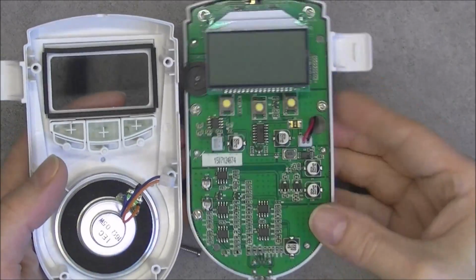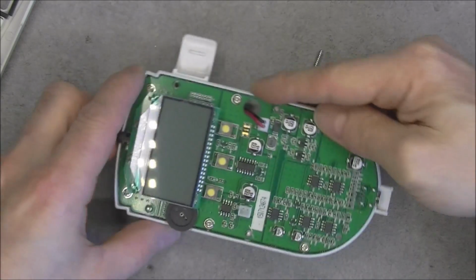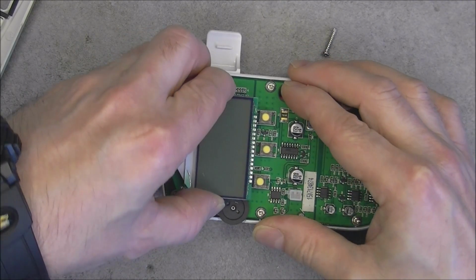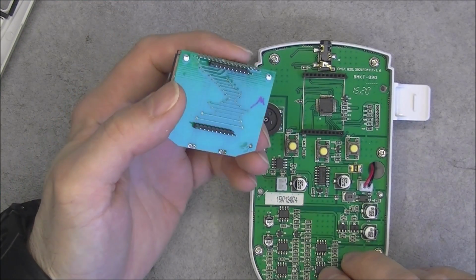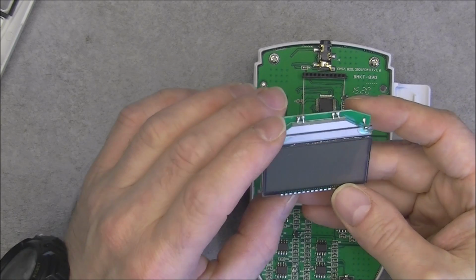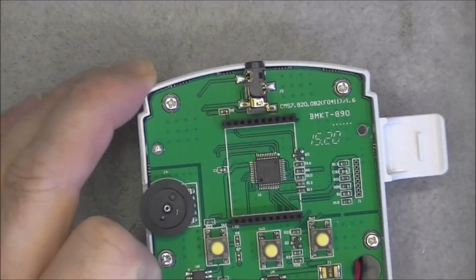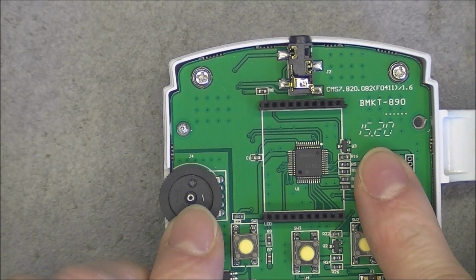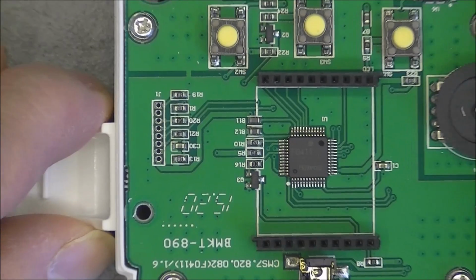So here we are, cover with loudspeaker that disconnects properly, and we just have a little LCD that can be removed like so. Custom LCD, obviously. Nice backlight here on the top. As you can see, the circuit board is quite well made, but really there is not much on it. Yes, we have a date code here of 2015. So we have what is probably one main microcontroller here.